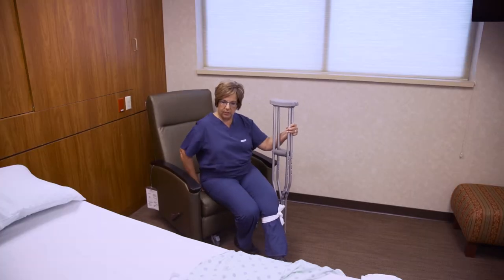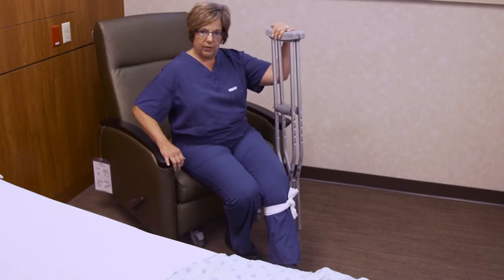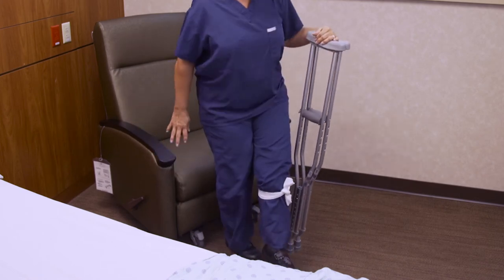When it's time to get up, move to the very edge of the seat. Hold your crutches on your surgical side and use your other hand to push off, using the crutches to keep your balance.